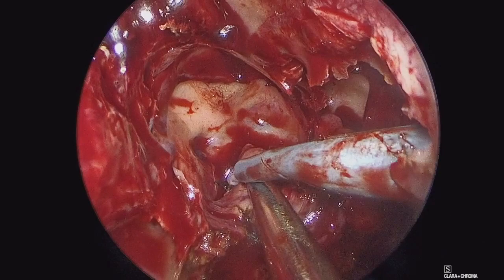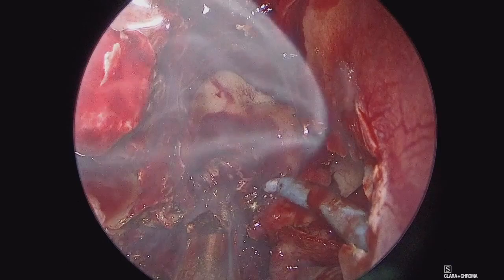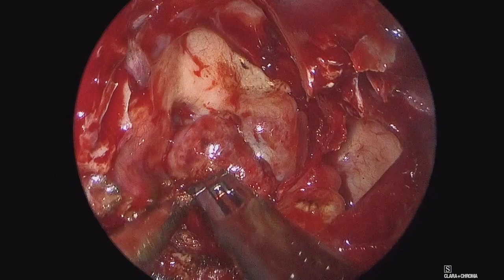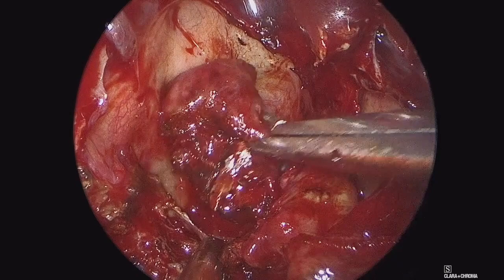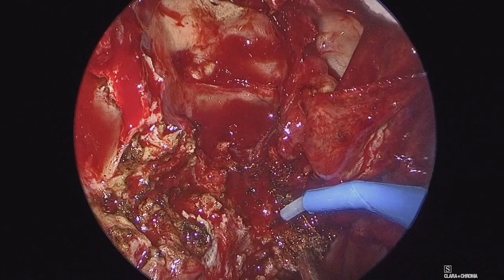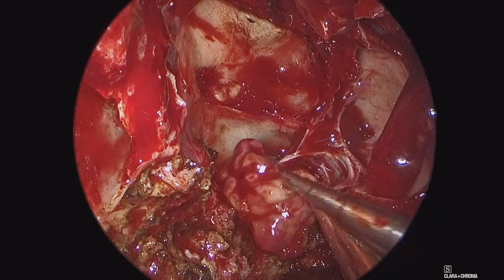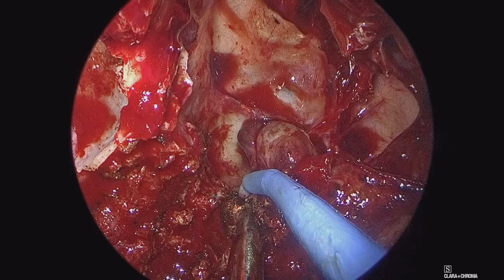We're now working above the tumor in the right sphenoid sinus. The base of the sphenoid sinus is one of the more common sites of recurrence of JNA — certainly an important area to dissect — and we'll drill that down to ensure no residual tumor. Just behind the tumor, you can see the optic-carotid recess. Here we are removing the bulk of the tumor in the right sphenoid sinus. In this case, the tumor does cross midline into the left sphenoid sinus as well, and here we are trimming the tumor off the base of the left sphenoid sinus. The tumor has some attachment at the base of both the right and left sphenoid sinuses.